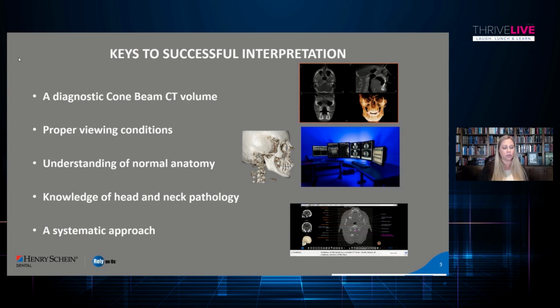So, for instance, if you were to use a pediatric setting for an adult, you would probably have increased noise in your image because you don't have enough radiation hitting the receptor. So you want to make sure that we have the appropriate exposure setting for each case.